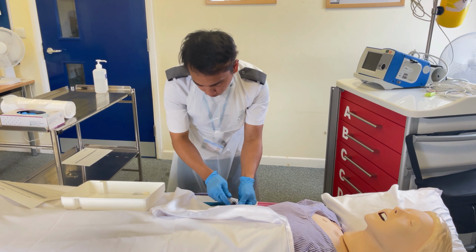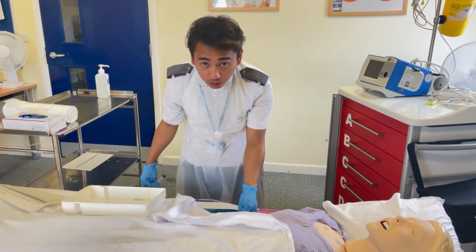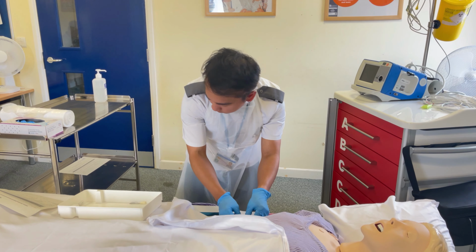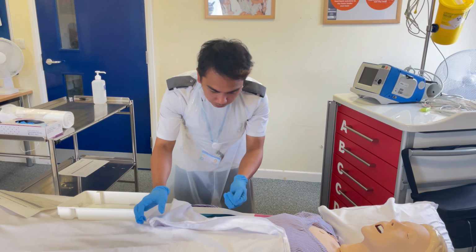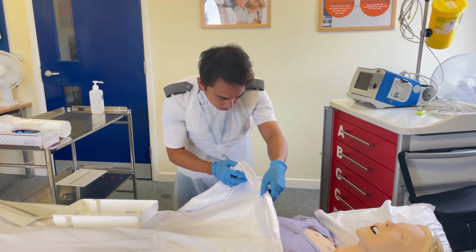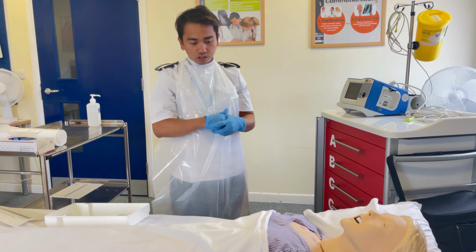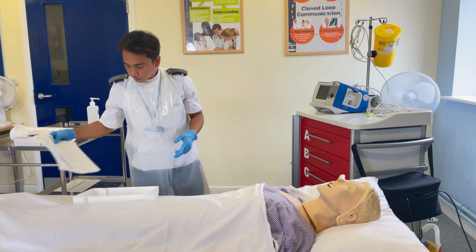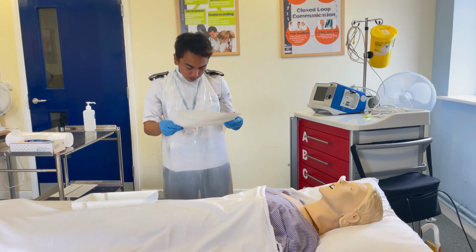All right, and then I'll dispose of this in a sharps bin. I'm just going to lock it as well. All right, Hausa, we're done with the procedure. I'll just have to recover you, okay? How are you feeling at the moment? I'm all right. Thank you so much for your cooperation. Do you have any questions for me? Nothing. Okay, and then I'll document later.